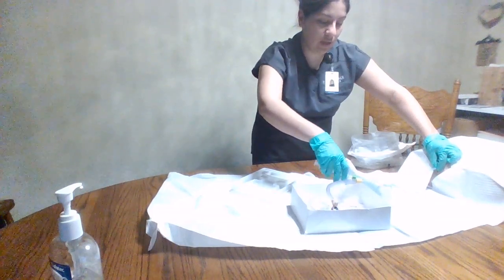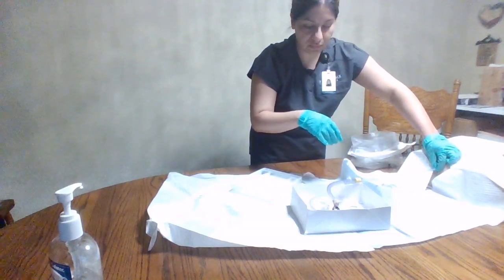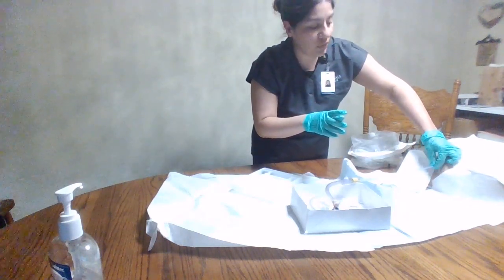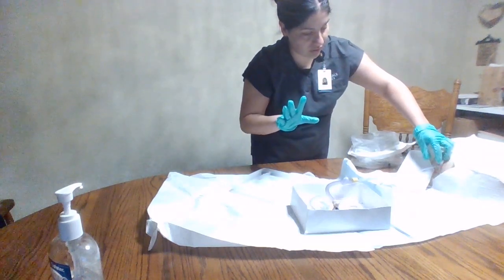And I will detach the syringe and dispose of that as well. With my non-dominant hand, I will slightly pull on the catheter. Once I feel resistance, I will stop. Okay, so I do feel some resistance, so we'll stop there.